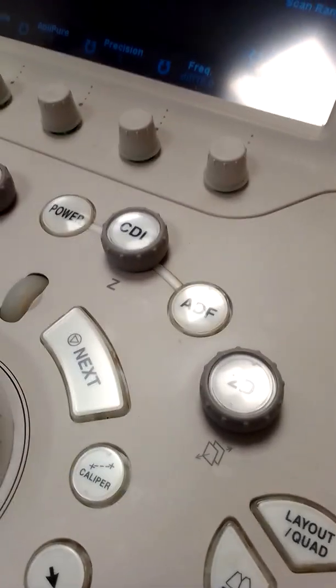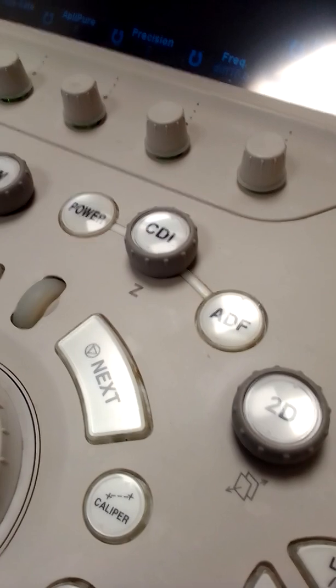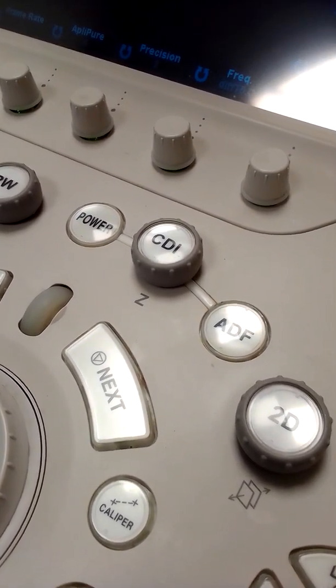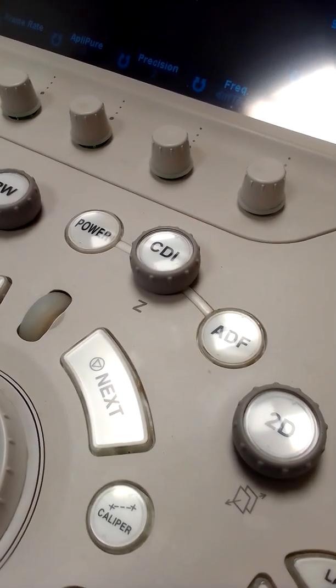Basically CDI can tell us, or we can examine by this mode, the motion of blood. Let's see, if we increase the gain, here you can see some colors are showing. This is the blood motion, toward and away. So again we press the 2D mode and we are back in grayscale mode.